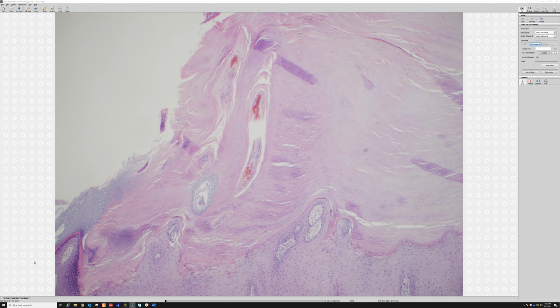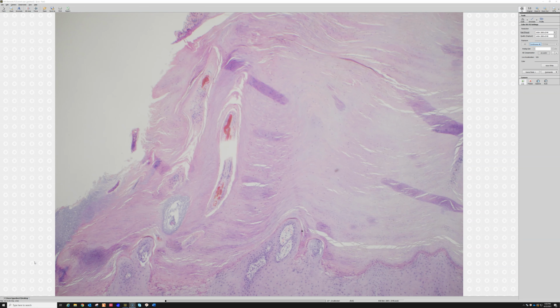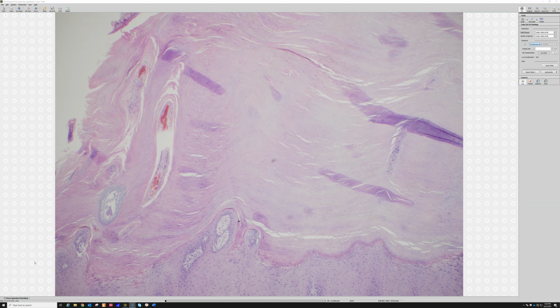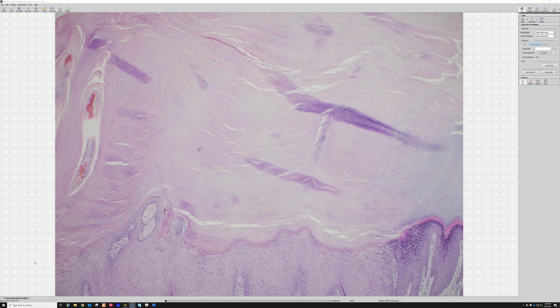All right, but I might say this very well could be the top of a wart, but I just can't see the bottom, especially in a sun-damaged older person and a broadly transected lesion where I don't see what it's doing at the base of the lesion, at the deepest part of the lesion. That's where I want to be cautious.